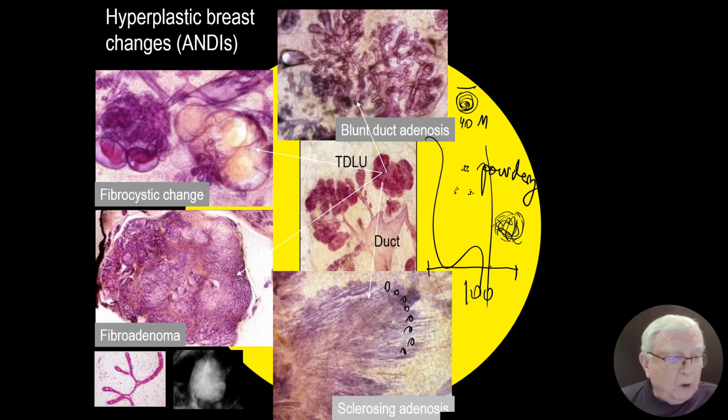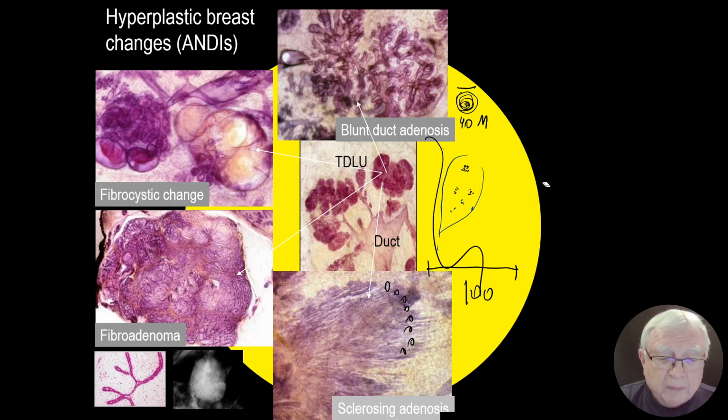Now we are in trouble because we see this on a region that occupies a whole lobe like this. And then the colleagues, the surgeons, come by and they say, would you mind doing core biopsy on this? Well, I don't like to do that because many times the calcification is there where there is sclerosing adenosis, but a non-calcified carcinoma may be there.